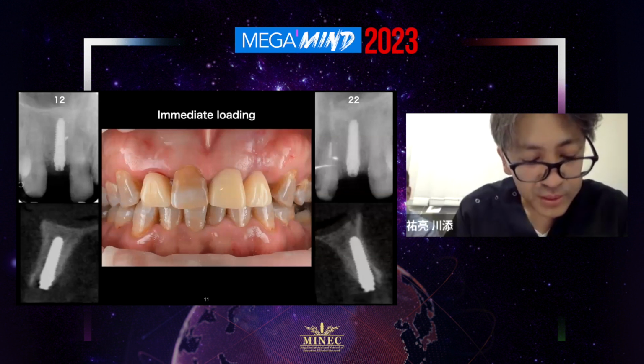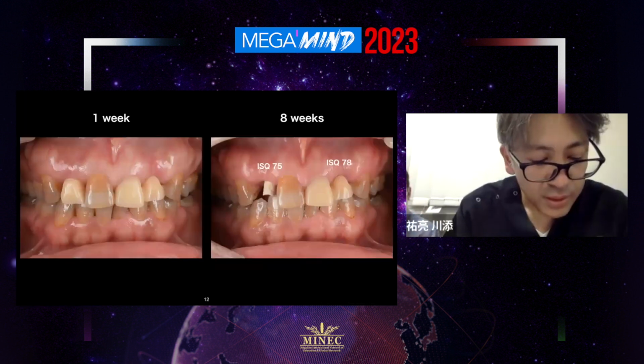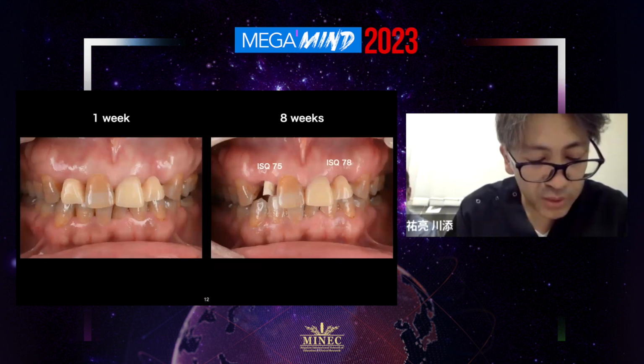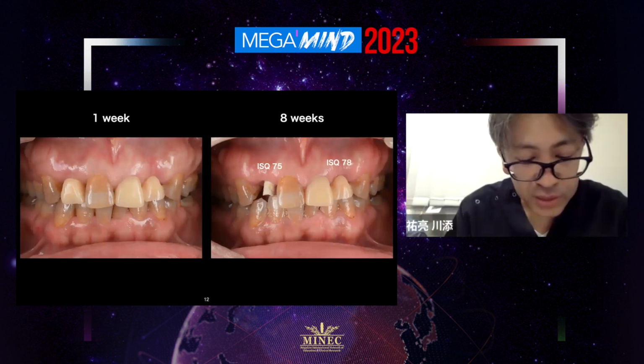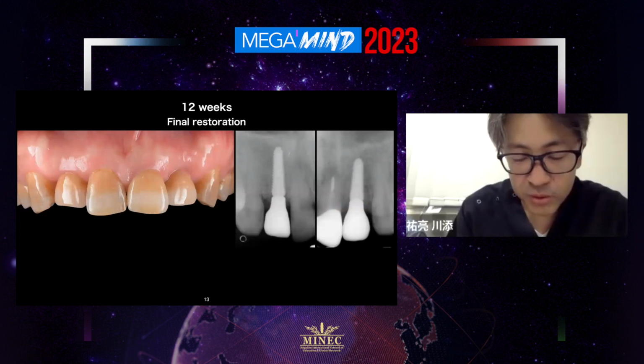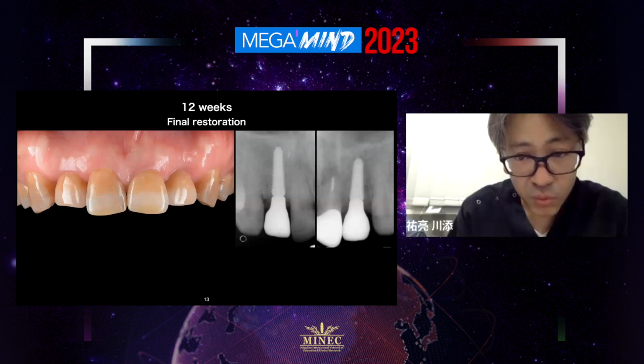X-ray showed that the implant was placed in the correct position. As the progress of the implant site was good, I measured the ISQ again 8 weeks after surgery. The ISQ was stable, so I took an impression. The implant superstructure was placed 12 weeks post-operatively. It can be seen that there is no marginal bone loss and progress is good.